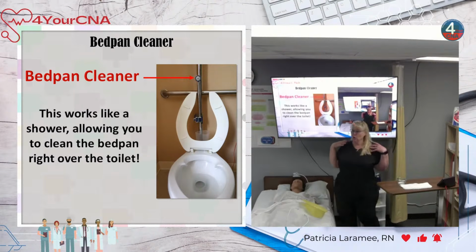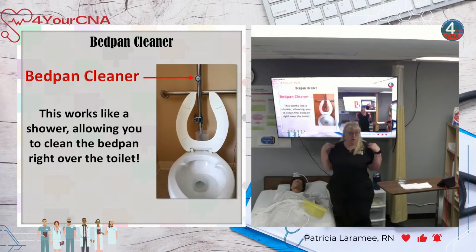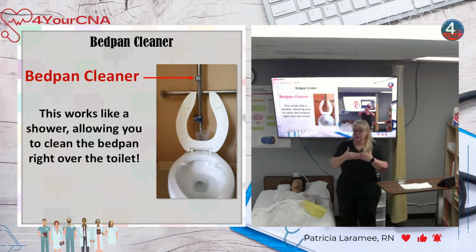We're going to put one of those isolation gowns, you know, the yellow disposable gowns that you see in healthcare. We put one of those on over our clothing, and the practice kit has those. You want something over the holes in your face. So a mask with a face shield or goggles. You don't want that body waste to be propelled into any of your holes. So you want to cover your holes.